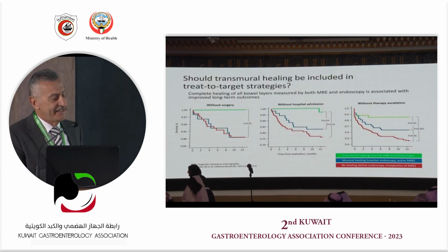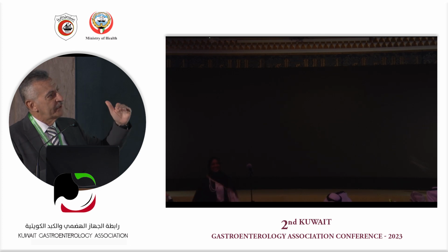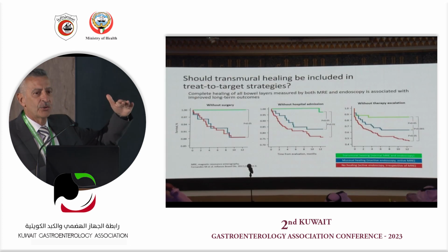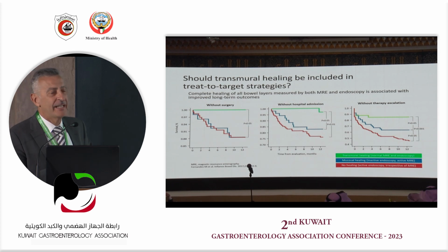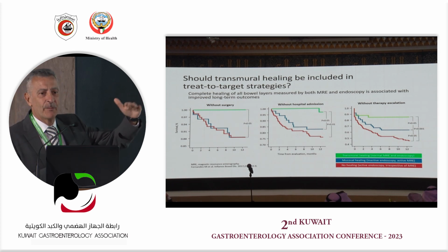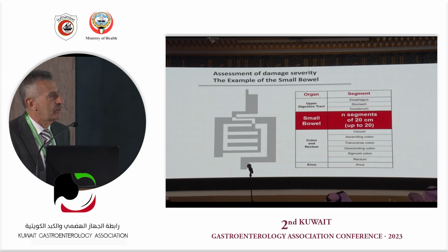But we're almost at the end. It's quite clear if you follow the green line: those are the patients with complete transmural healing with MRI. There is a clear separation also compared to endoscopic healing. So again, probably we have to move in that direction, especially in patients in whom we can achieve it early.